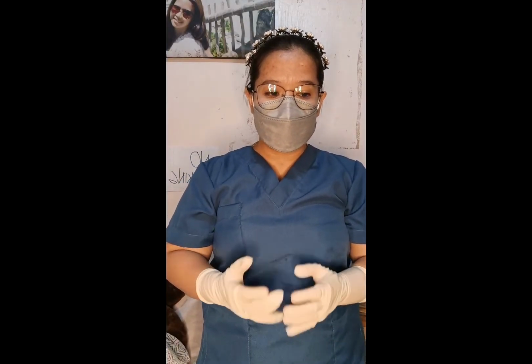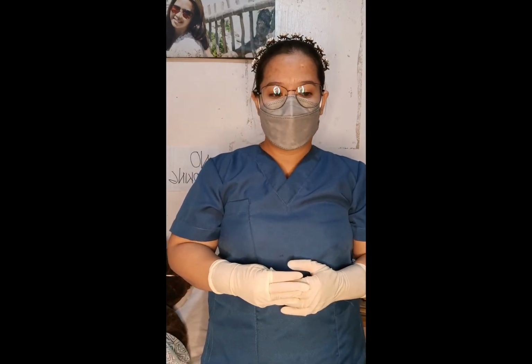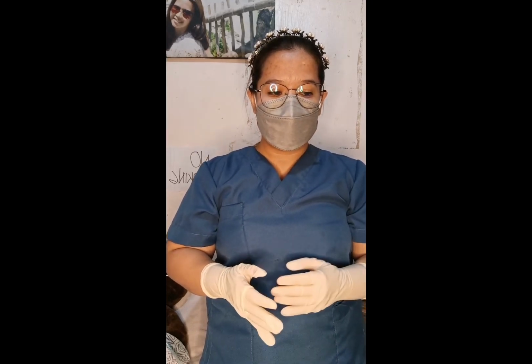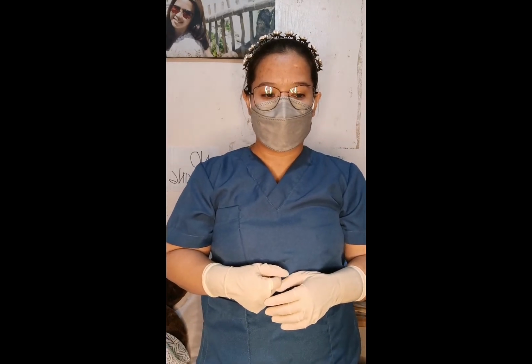So, we need to assess for proper functioning of the equipment and observe the client's initial response. We need to continue to monitor the therapy for pressure areas on the skin and nerves every 2 hours and recheck the flow rate every 4 to 8 hours. Once we're done administering the oxygen, we need to remove our surgical gloves and wash our hands.